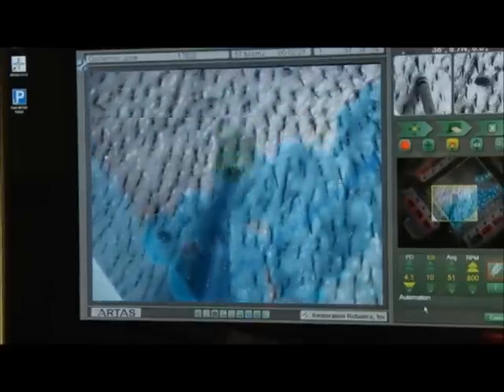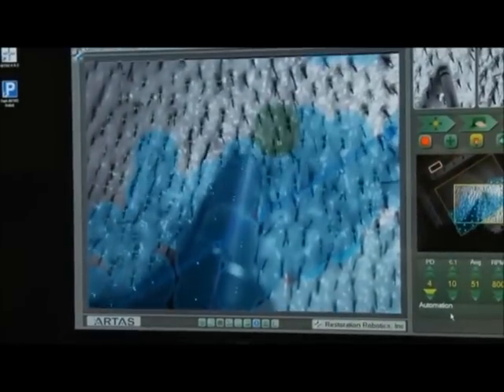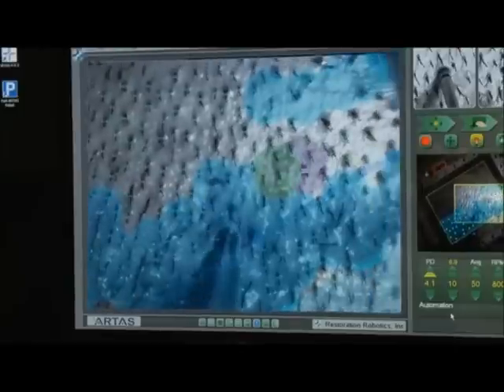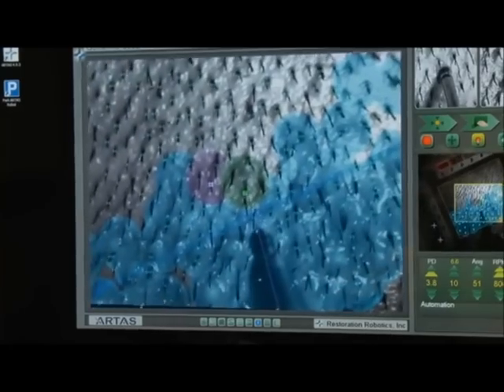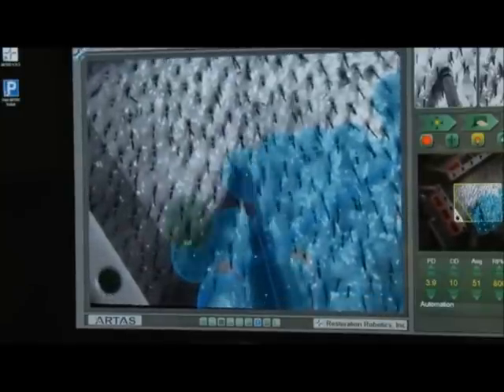The reason why there's no bleeding is a combination of the adrenaline we put into the scalp, but mostly the action of the tensioner, which puts traction on the skin. It's important to have the hair at less than 1 millimeter in length. The robot also reads contrast between skin color and hair color, so if someone has white hair, they need to dye the hair the day before treatment. We have the patient cut the hair short, dye it to ensure the root is colored, then reclip the hair the morning of surgery.